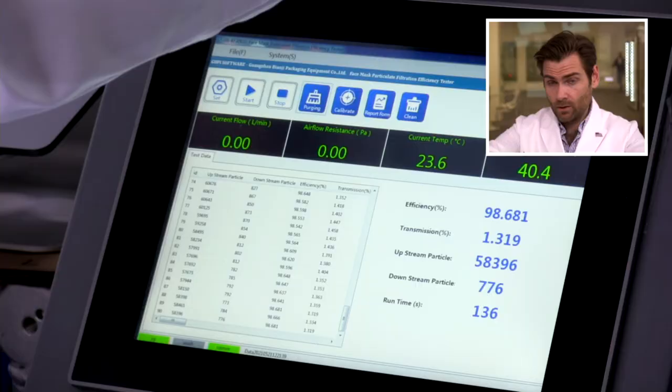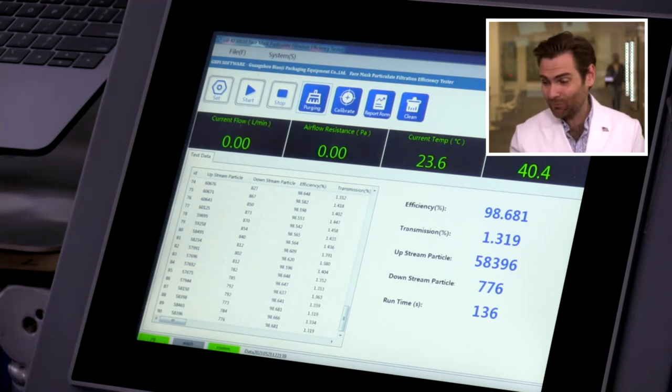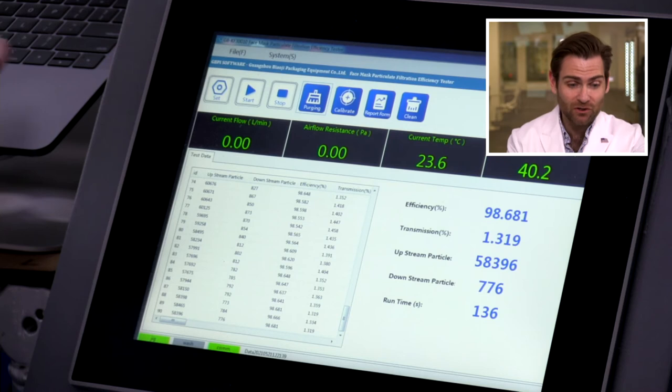98%! 98.681 — that's insane, that's really good. We've been having some good masks today. For a black on black mask made in China, this is your mask — highly recommend. Now, usually you'd test multiple ones, but man, that is a really good mask. 98.68%! Good job, guys.